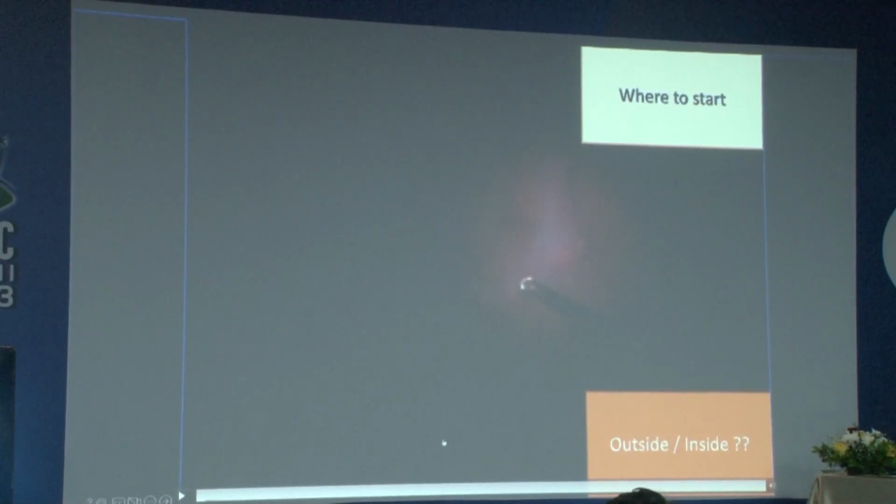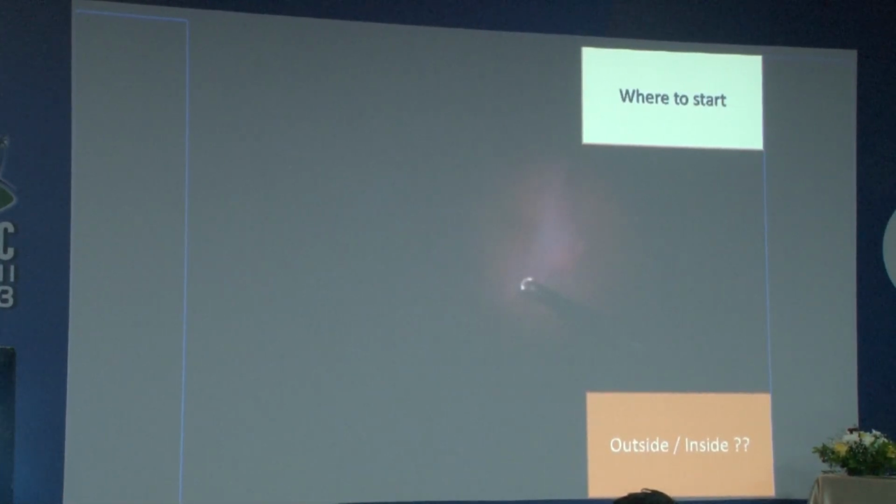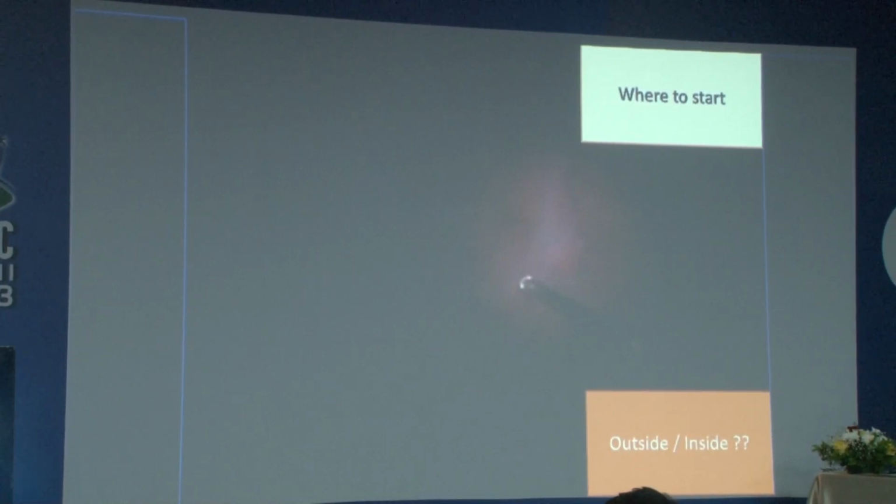So the discussion at this point was whether I had already jumped into the surgery, which we were discussing whether to do or not do. I was an aggressive surgeon before, and then after a lot of mistakes, I have learned that you are growing up, growing old, with a lot of gray matter and gray hairs. Whether to go from outside in or inside out, I think we would not have operated. So we go to the part of the surgery where I had done the surgery and then managed it.